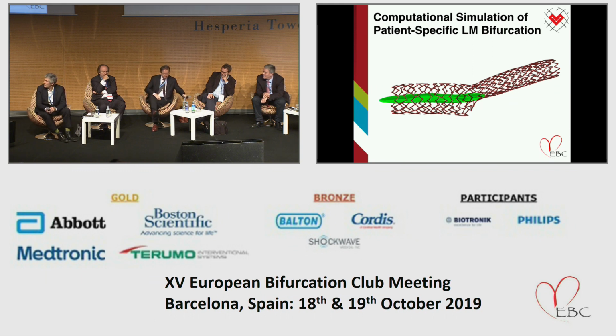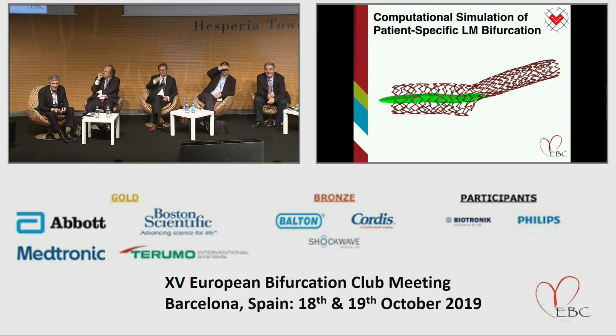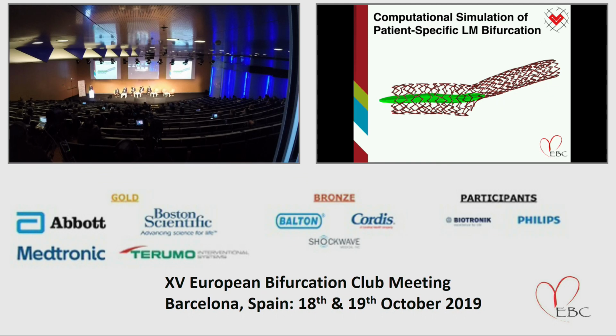Yes, true. A large number of left main patients are high bleeding risk patients, and putting a Synergy stent in left main, how much DAPT do you recommend? I guess what the guidelines dictate. Guidelines, Synergy has been tested for 1 to 3 months also. But in left main, do you want to say something special about that particular stent? I wouldn't feel comfortable with 3 months of DAPT in the left main. But Synergy has been tested against HBR for 3 months. I don't think we can take the risk of left main thrombosis. And we will discuss that tomorrow in the consensus session. So let's focus on this session.